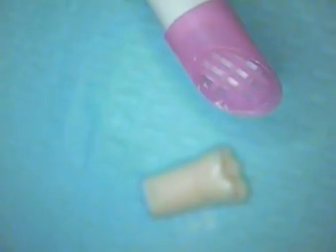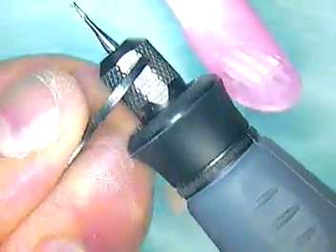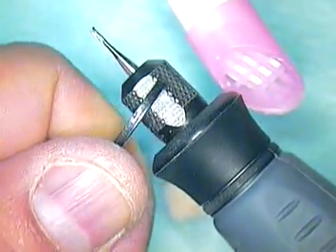I'm going to switch now to my 556. I'll use my wrench — I'm going to hold this button in when I'm changing my burs. That gets held in, this gets undone, and the bur comes flying out. We'll put the 556 in now that we know we can cut straight. I like to put the bur in to right about where it starts to taper — I'm comfortable with that.